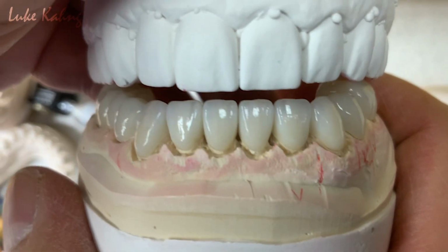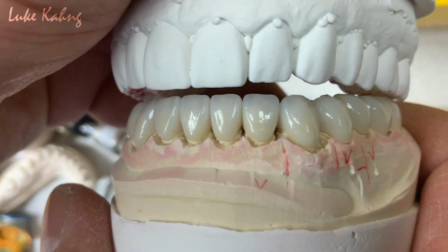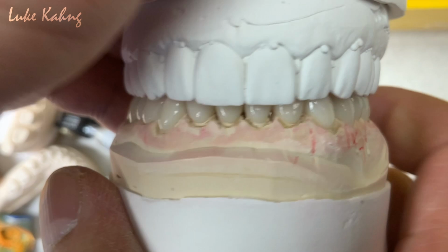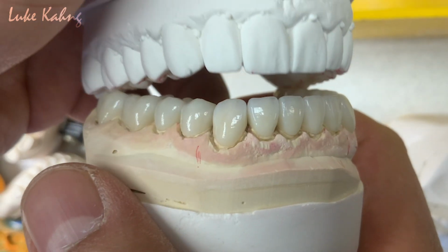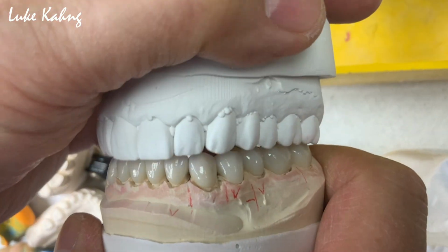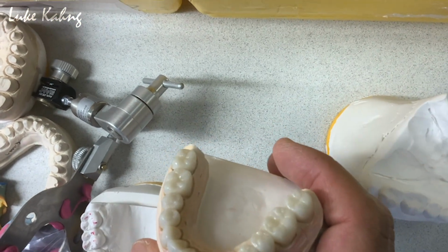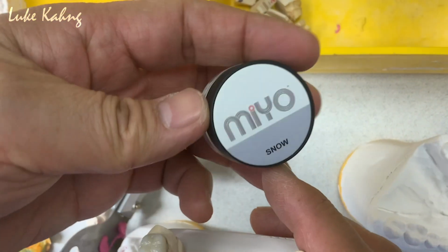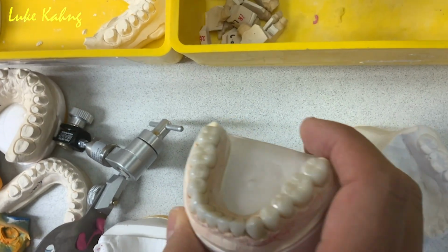Right? The size was a little bit too big, so I'm trying to make the embrasure more open. You saw the old LiSi press. You can do either wax, or you can do LiSi milling directly. And then on top of that, I'm using the MIYO product. You saw my video too. That one is really helpful for the monolithic, 720 Celsius around. So that's why I finish it.